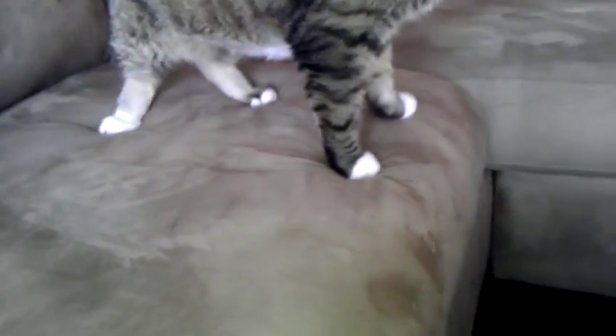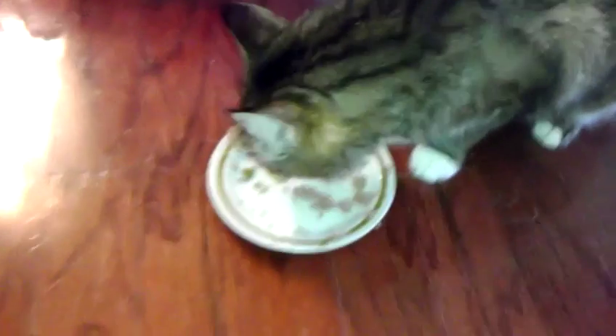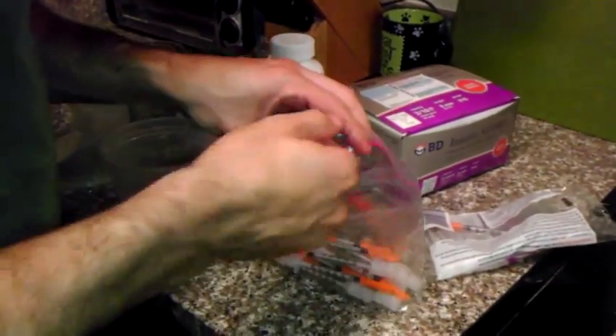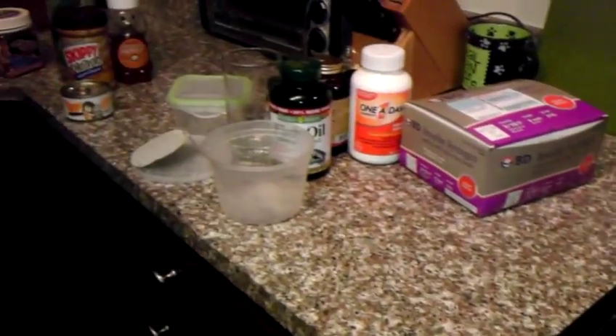I'll take the extra syringe. I can give him like four or five on this plate — it's fine. And that's it. I put the used syringe away into the used syringe baggie and throw the three things away into the cabinet, and then that's the end of it.